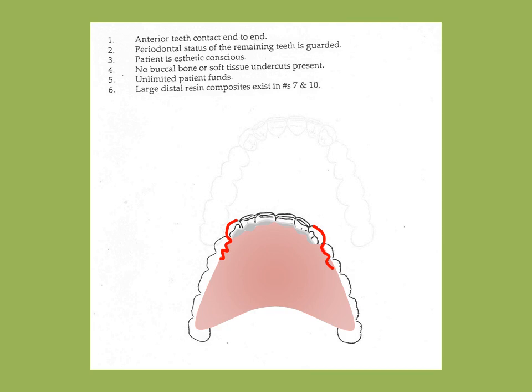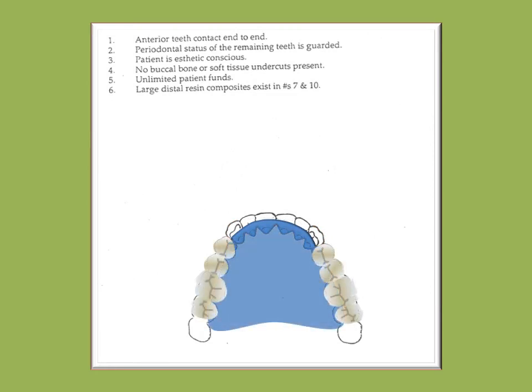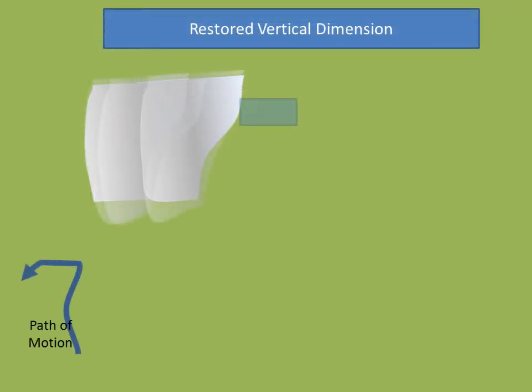These factors, as well as Dr. Stickfigure's suggestions for making every day perfect, have been accomplished. Yes, Marie, you know, I grovel at the feet of Dr. Stickfigure. Now, the 6-unit fixed partial denture with semi-precision attachments may be fabricated and placed. Yes, Dr. Goon, the patient has indicated her approval and subsequently a definitive cast metal partial denture will be inserted. It is important to maintain a recall schedule for this patient, primarily to ensure that her desk is free from clutter. Right, Dr. Stickfigure.